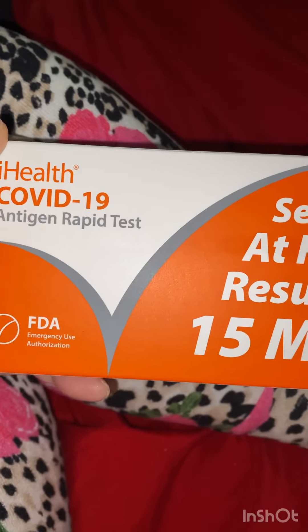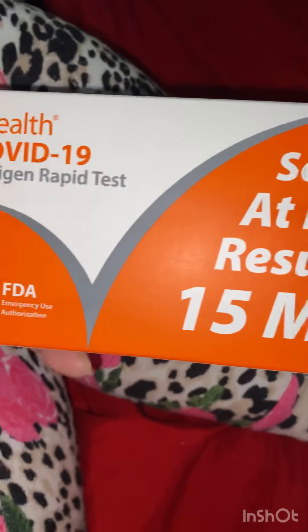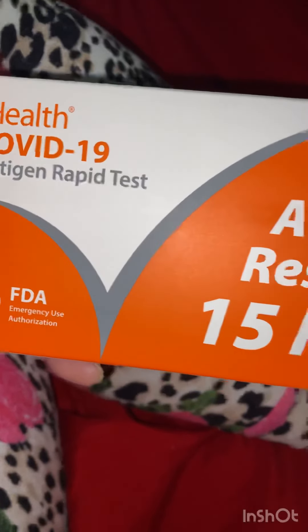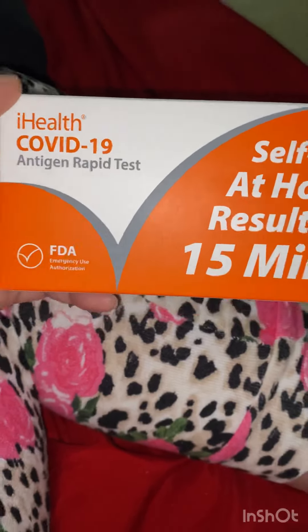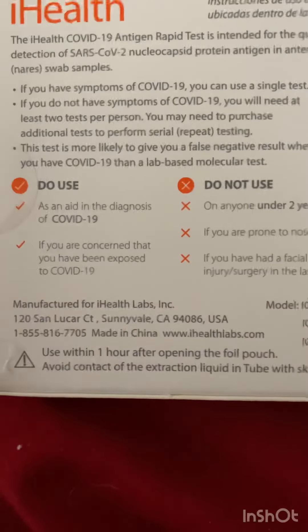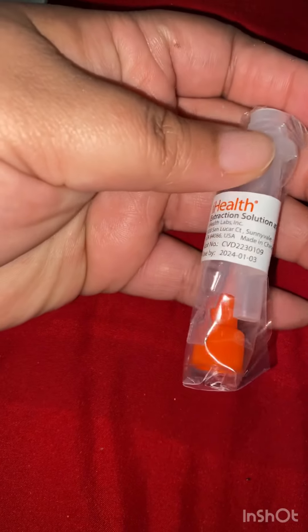I'm about to use these government at-home tests. Kaylee is sniffing and coughing — that was her in the back sniffing. Let's see if she has COVID. She's been at school. We don't have any bleach, she had no facial surgery, so we're going to use these. We got extraction solution and two tests.